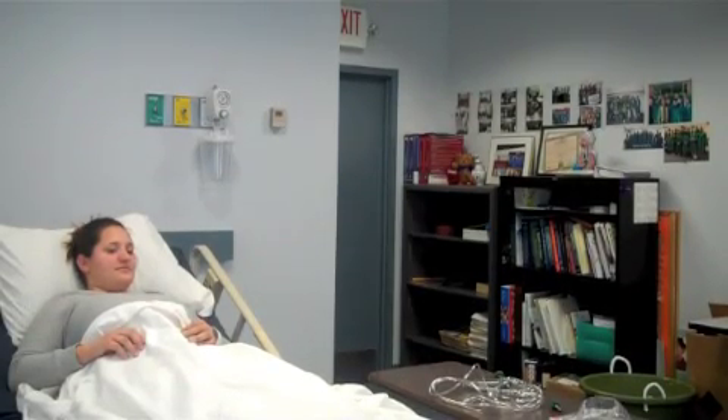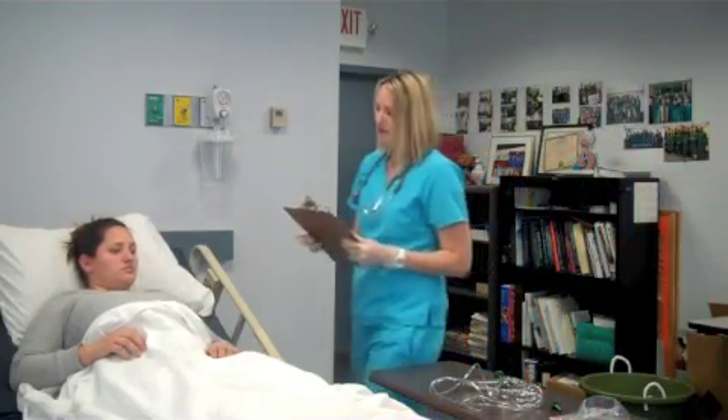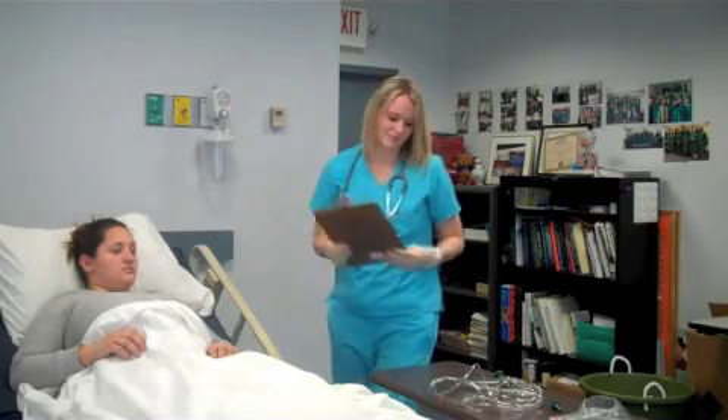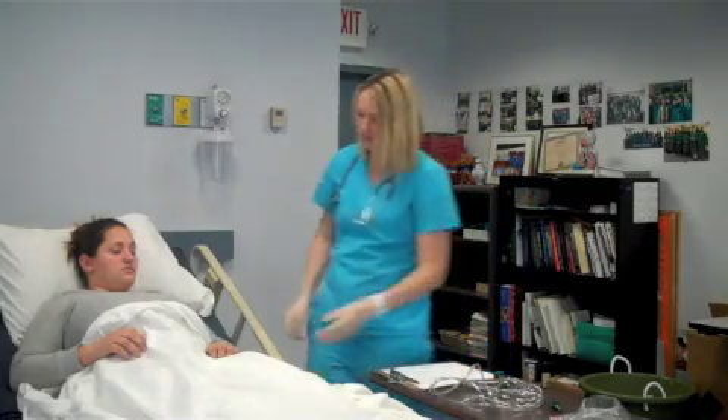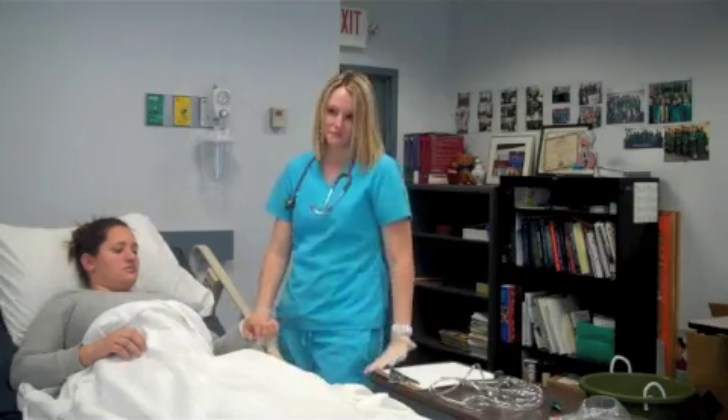Today we're going to show how you properly give oxygen therapy to a patient by way of a simple oxygen mask. Before ever giving a patient any type of oxygen therapy, first you want to make sure to check their chart for a current physician's order. Secondly, make sure to check the patient's armband to identify that the patient you are giving the oxygen therapy to is the correct patient.